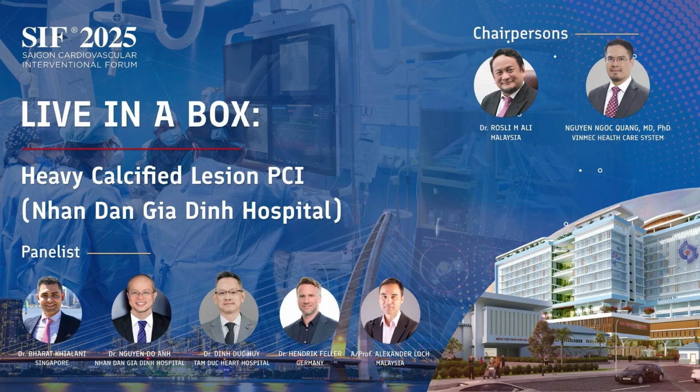So on our side, we tend to pre-dilate first just to get the vessel to open up a bit. And then we will be able to use Lithix in multiple lesions, and most times it works. So, Rosalie, you mean that you use a non-compliant balloon first to open up and see, and after that you choose the size of the lithotripsy, right?